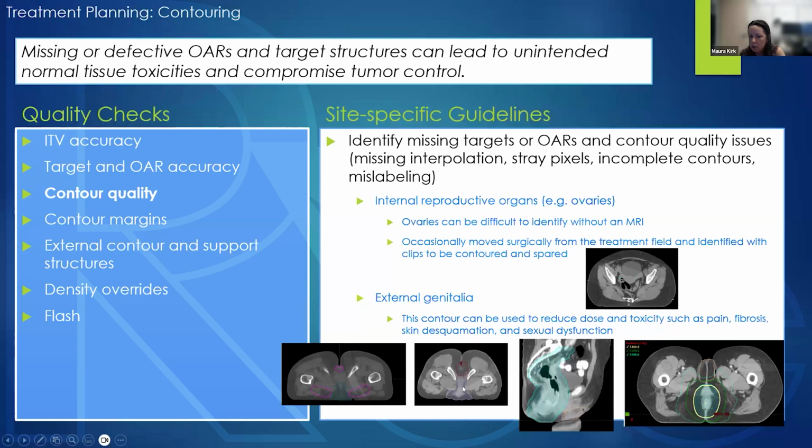And that's going to be used to push doses away from that anterior side of the patient, where even low doses can cause excess toxicity. Here are some isodose lines just curving back around that contour, which was used in the optimization.